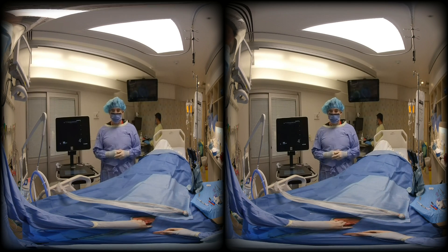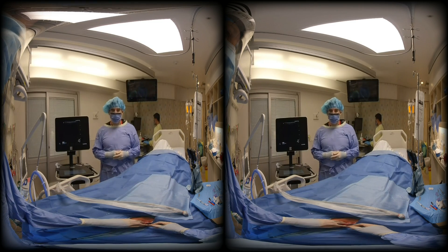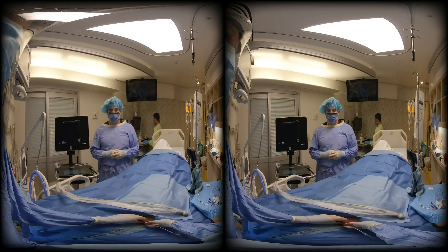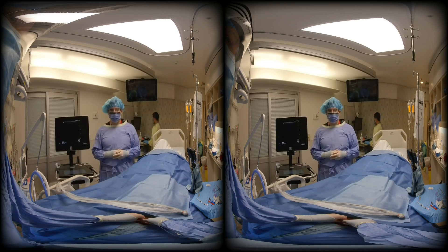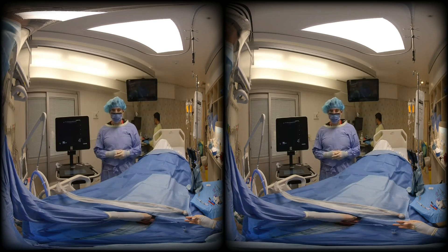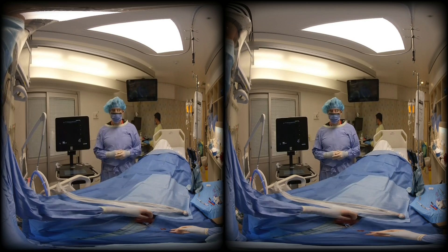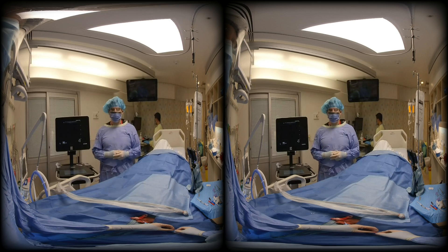After removing the dilator, you will now advance the central venous catheter over the wire, being mindful that you have controlled the wire at all times. This wire should be held at the skin level and the catheter advanced over it. Once you have a few centimeters sticking out of the opposing end of the catheter, secure the wire on one side while the other hand advances the catheter. Never let go of the wire.